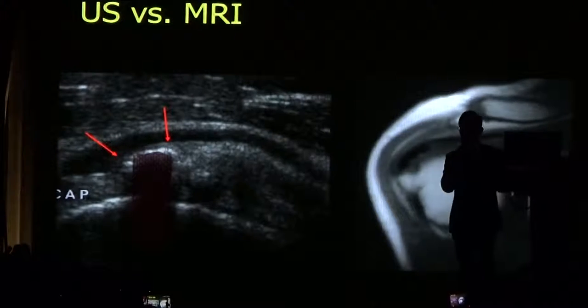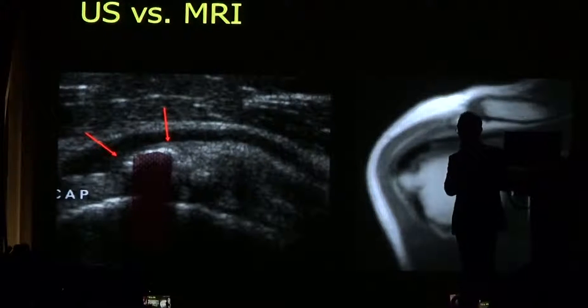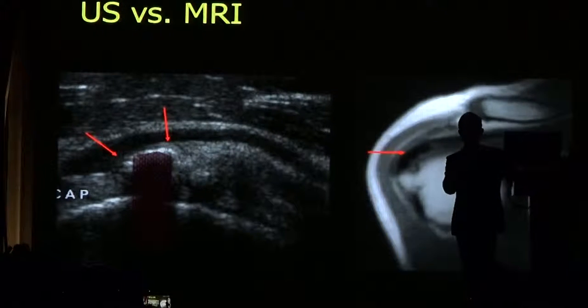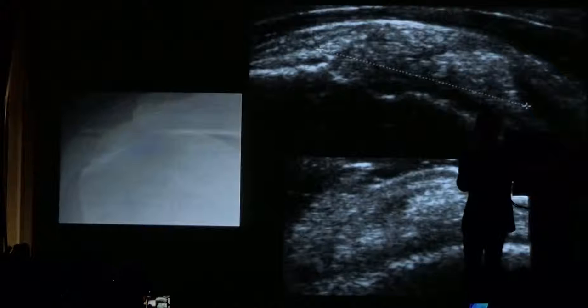On MRI, it can be a very difficult diagnosis to make because tendons are normally black on all sequences on MRI. You may notice an area of increased low signal within the tendon indicating calcification. Another example here of an acute phase calcification on X-ray.